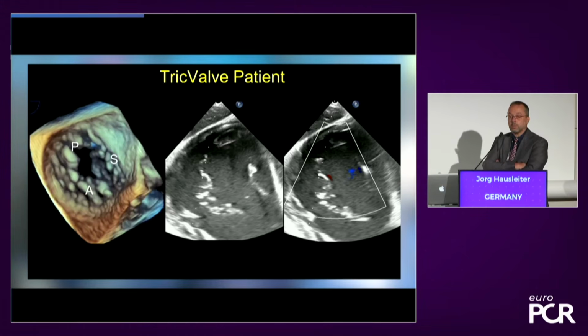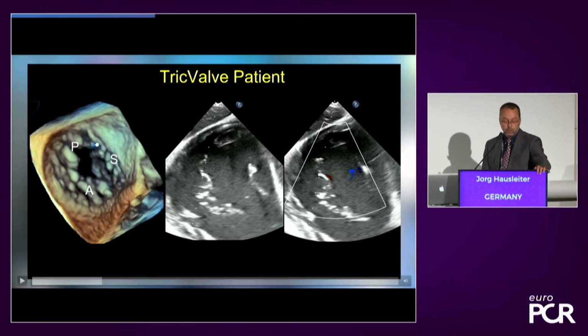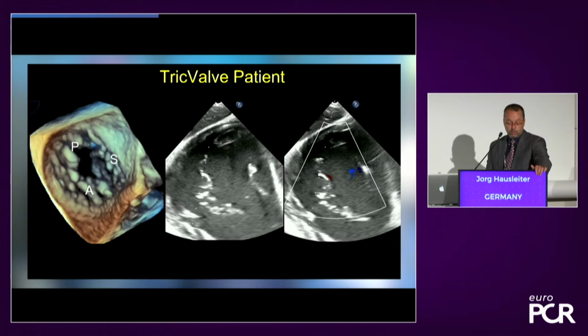For this workup, we have to understand that for other therapies, for an edge-to-edge therapy, for example, we would consider patients suitable if the coaptation gap is probably below 8 millimeters, not above 8 millimeters. Here, we had a coaptation gap somewhere around 10 millimeters. And also the posteroseptal line of coaptation, if the origin is here, the hole is in its lower part, this is also less favorable for an edge-to-edge repair, and we usually see a higher recurrence rate for this patient.